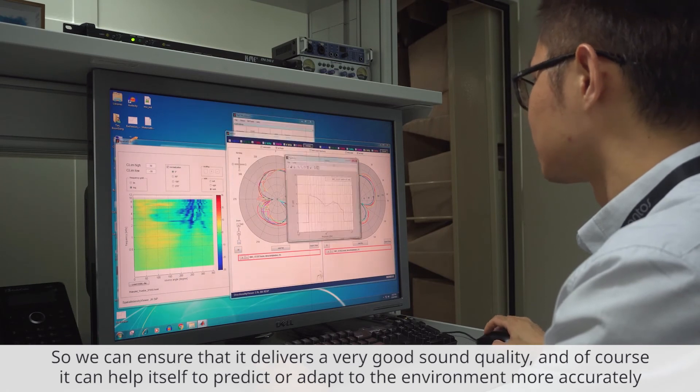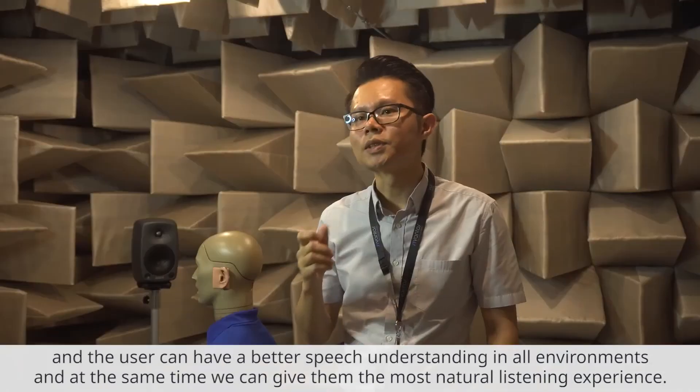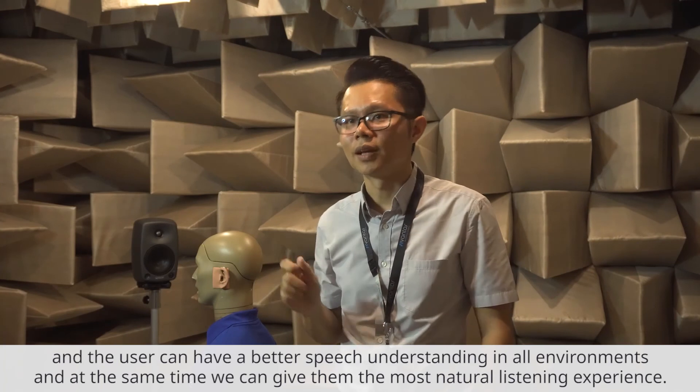And of course, it can help itself to predict or adapt to the environment more accurately, and the user can have better speech understanding in any environment. At the same time, we can give them the most natural listening experience.